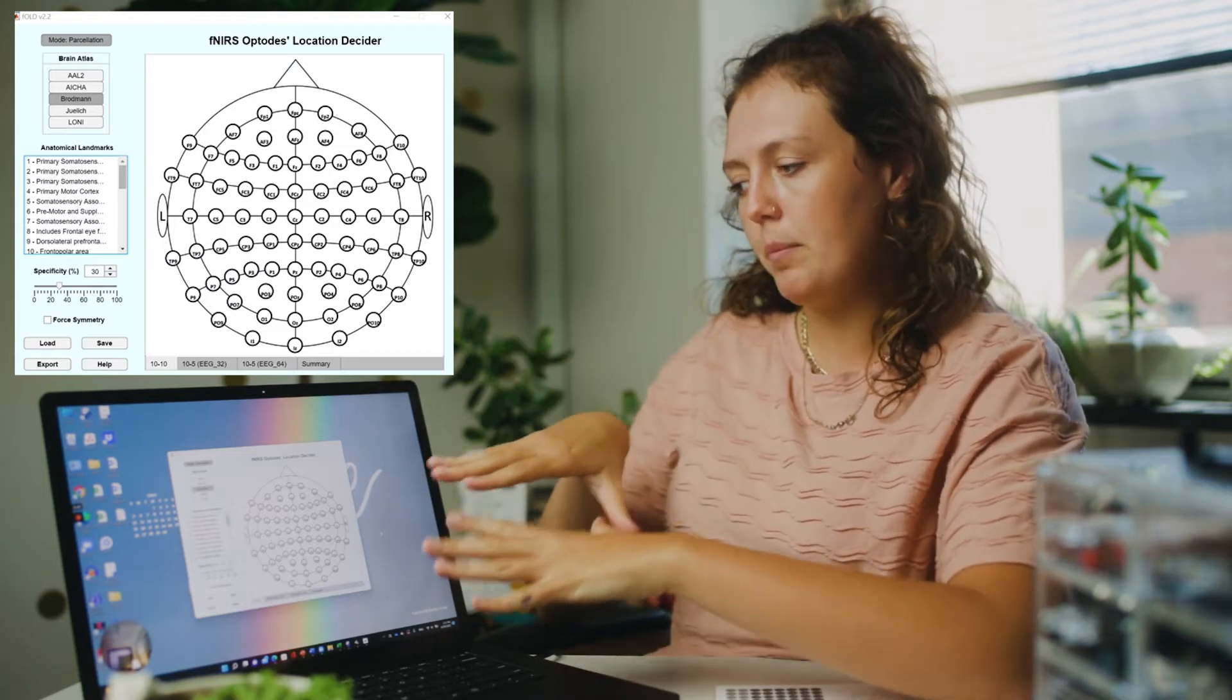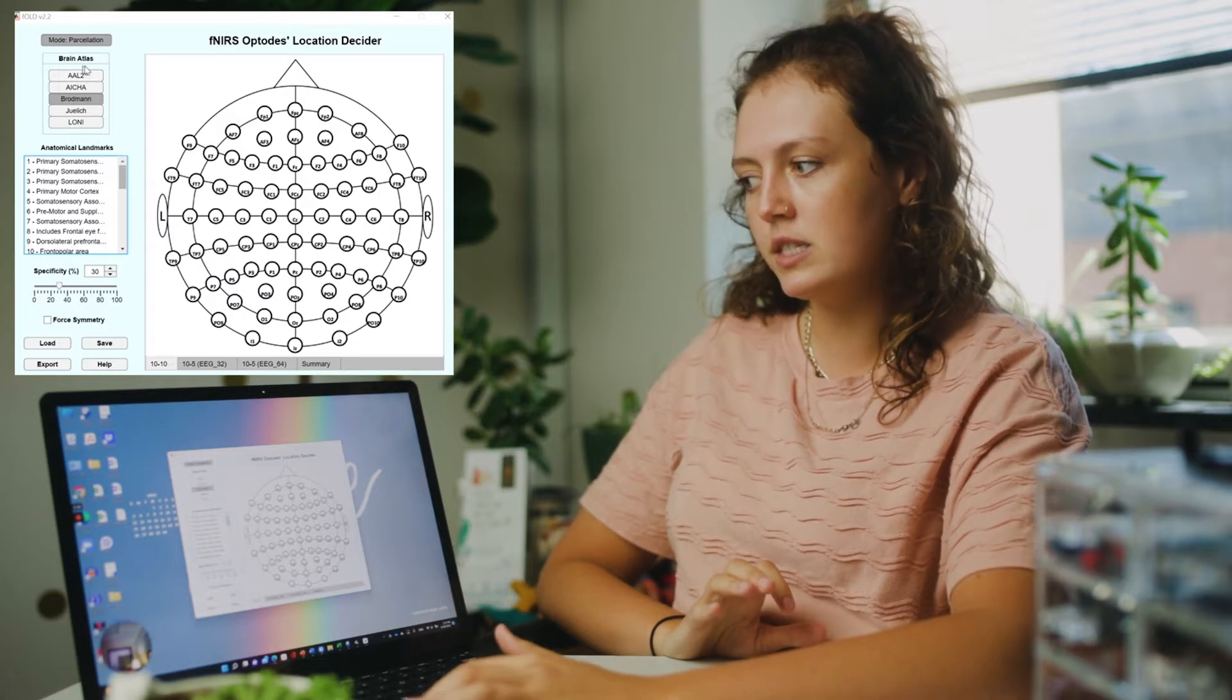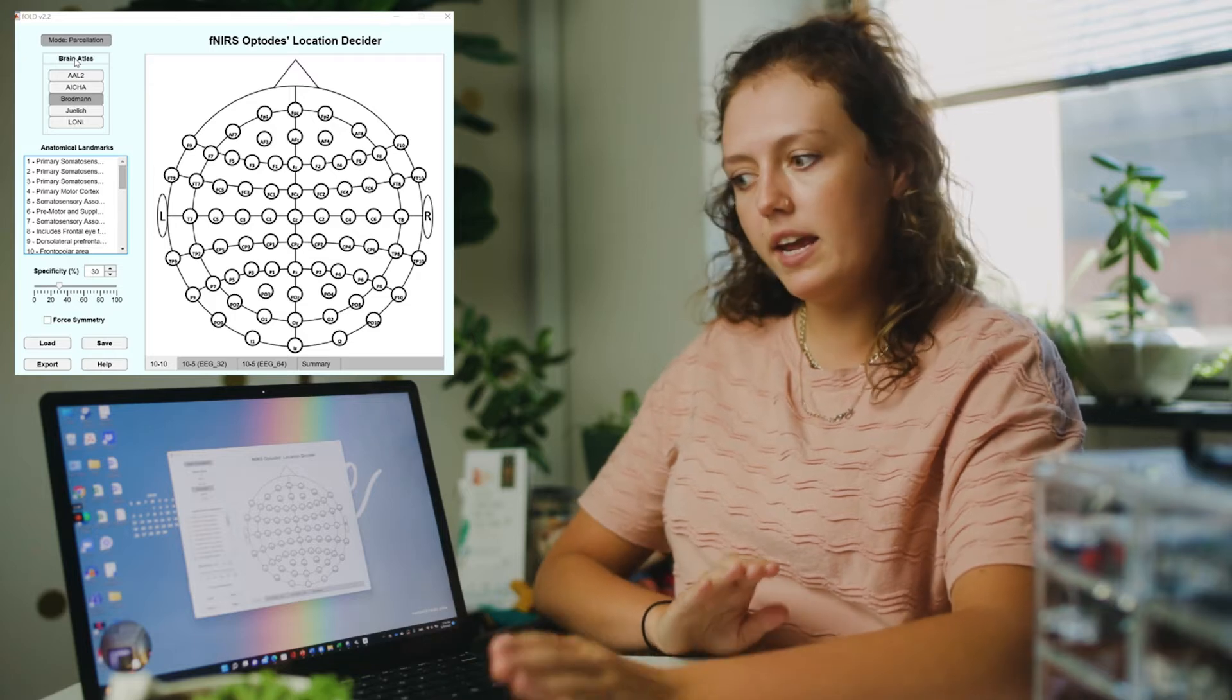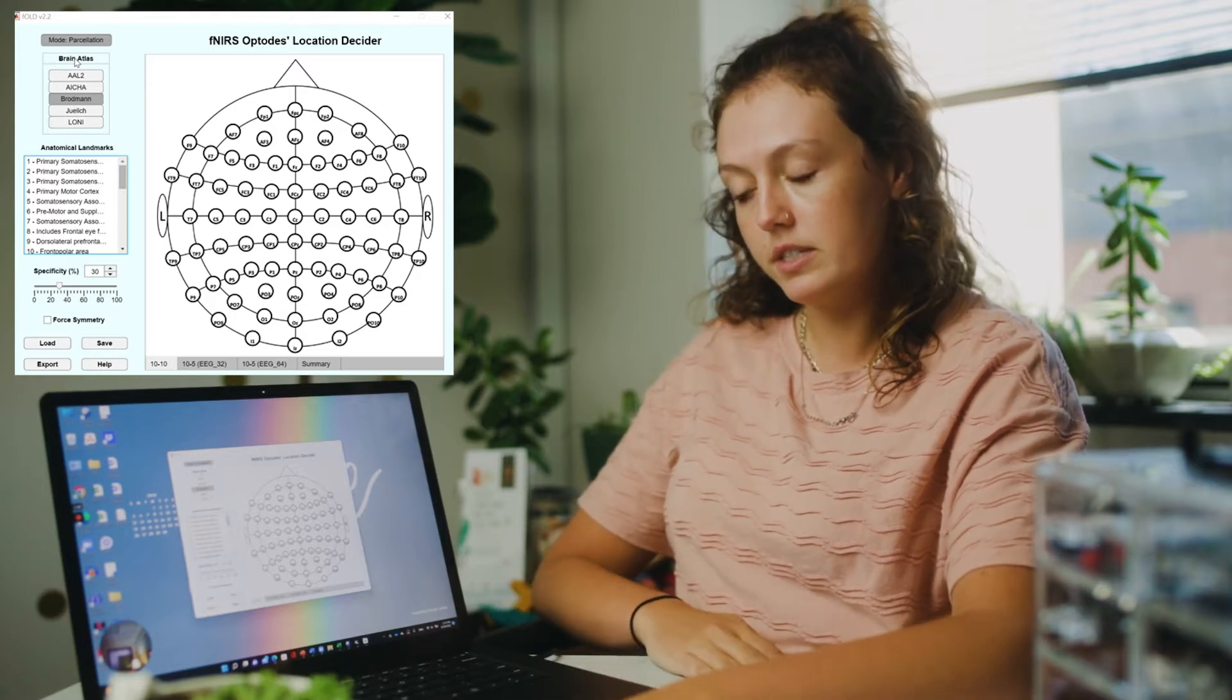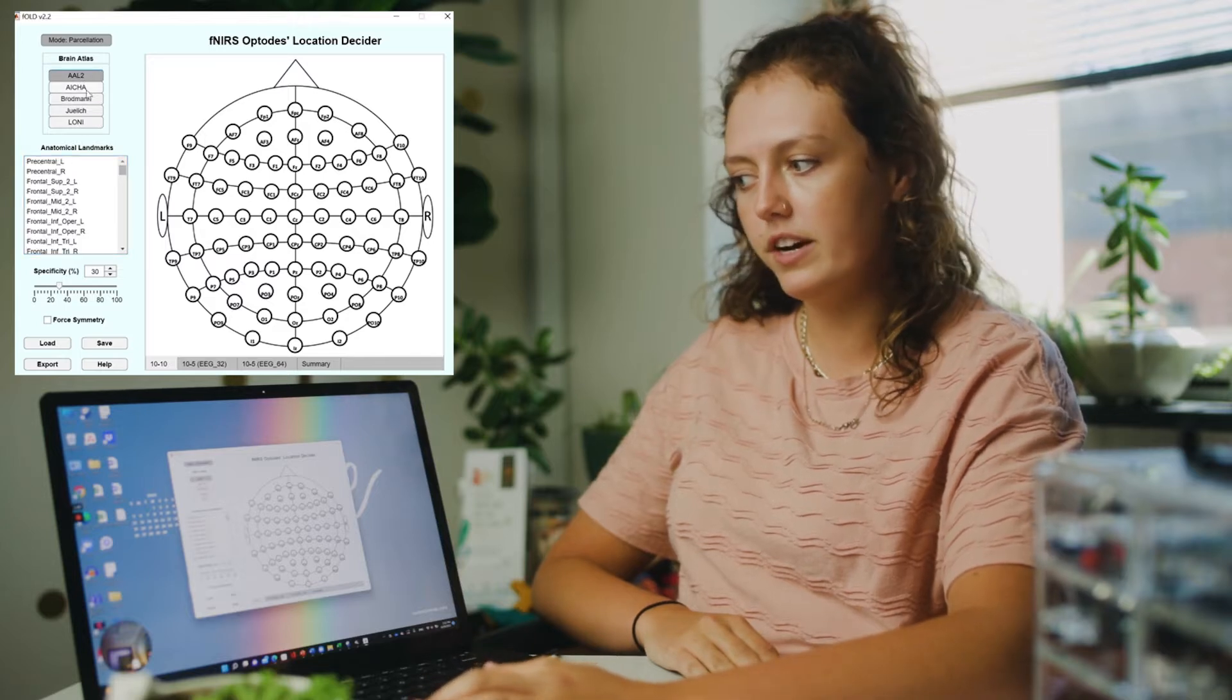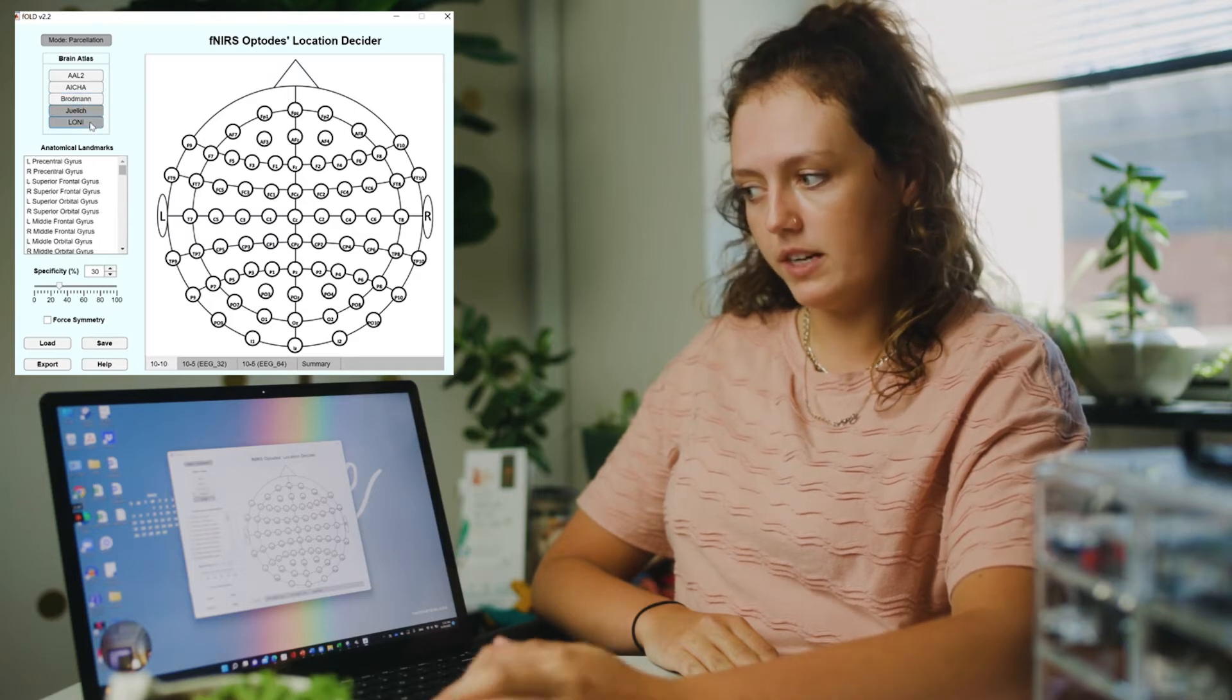FOLD, the application, has five parcellations that split up the anatomical regions of the brain in different ways. So depending on the brain regions of interest, the anatomical locations of interest for your study, you can go through these various atlases and decide what regions you want to cover.